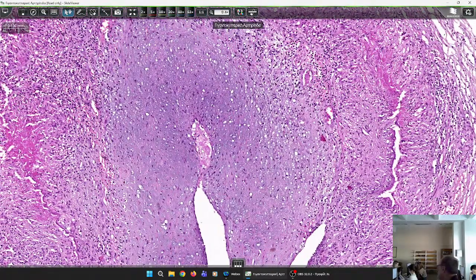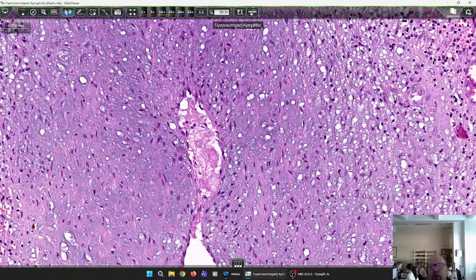This might cause a severe problem, especially if the ophthalmic artery is involved by the inflammatory process. What is being formed here in this part? What can this be? Look, it's something within the lumen. So, a thrombus, yes, this is a clot.